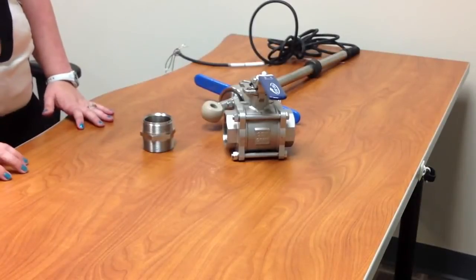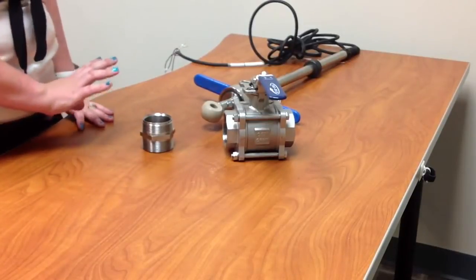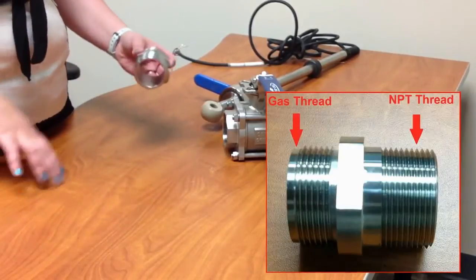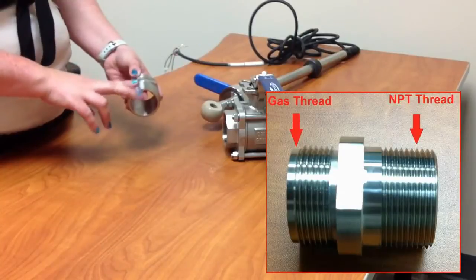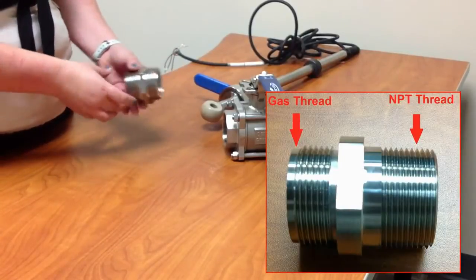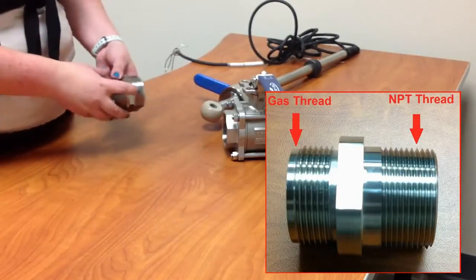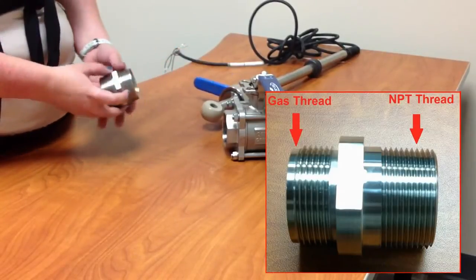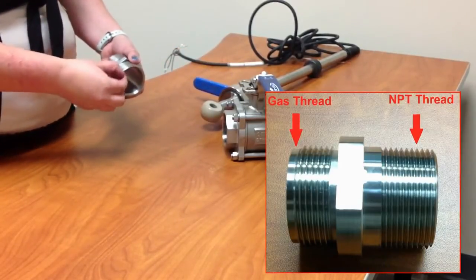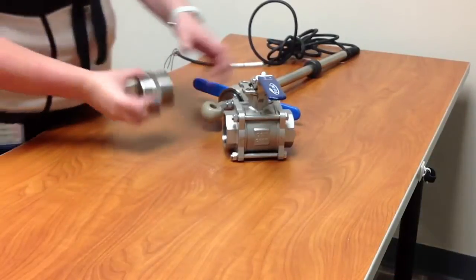Quickly we're going to go over the installation steps of your PR-10 assembly into your process. In your box you'll have a process adapter. There's two different types of threads: an NPT thread and a gas thread. The NPT thread goes into the ball valve. The gas thread goes into your PR-10 assembly. The gas thread has a little bit of a solid lip so you know that's the actual gas thread.